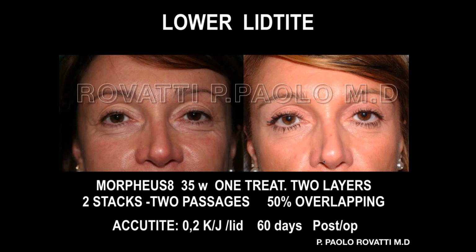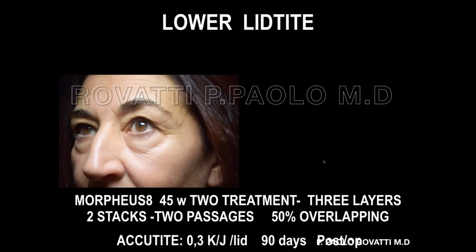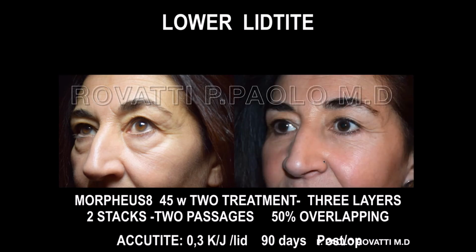This is when I understood not to go too high, near the eyelash. And now we have a good result with Morpheus and AccuTite. Usually I treat with 2 devices, 2 probes, so I'm combining the techniques. This is really good even for fractional, because I'm treating only the skin with 1 or 2 layers. I like this one because she didn't want to do blepharoplasty, though I proposed it, but I was not so convinced about the results. Anyway, we have a good result, no scar, and good results even without blepharoplasty.